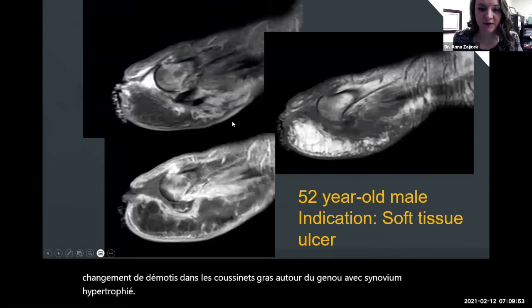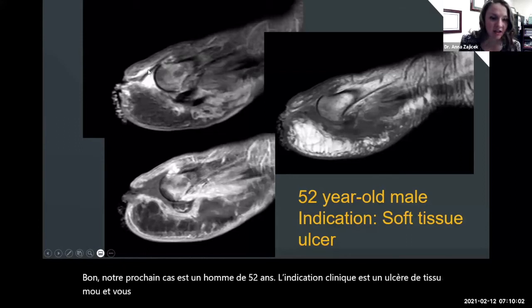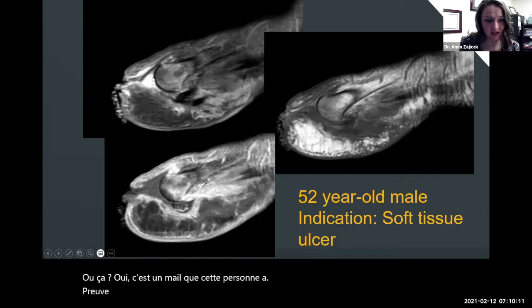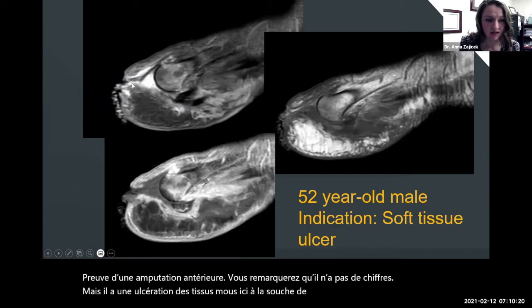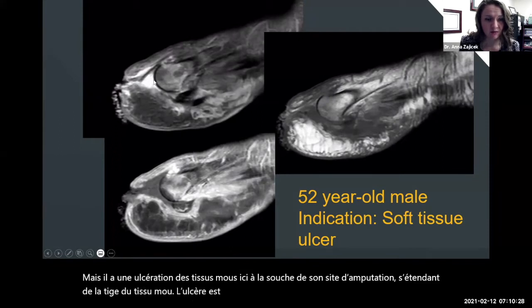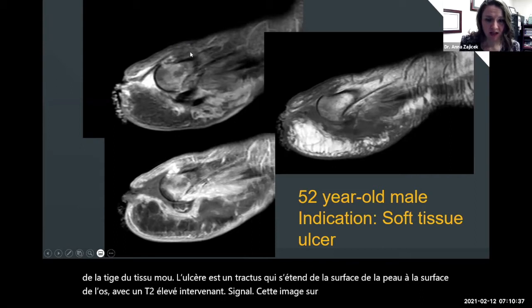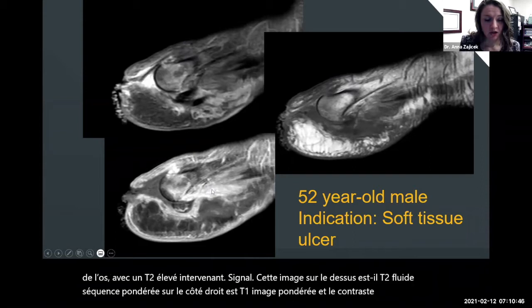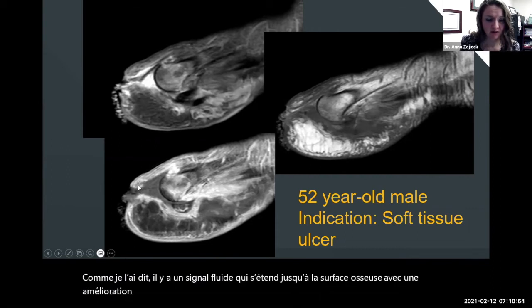Our next case is a 52-year-old male with a soft tissue ulcer. This person has evidence of a prior amputation — no digits. There's a soft tissue ulceration at the stump of the amputation site. Extending from the soft tissue ulcer is a tract extending from the skin surface to the bone surface with intervening high T2 signal. The top image is a T2 fluid-weighted sequence; on the right is a T1-weighted image, and the post-contrast image is below. There is fluid signal extending to the bone surface with peripheral enhancement — concerning for a sinus tract and an abscess.